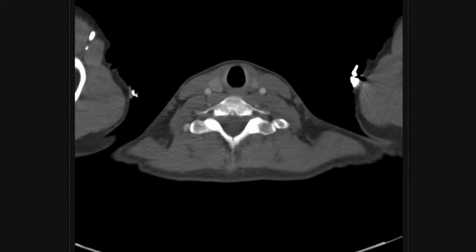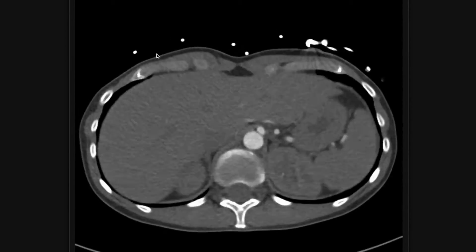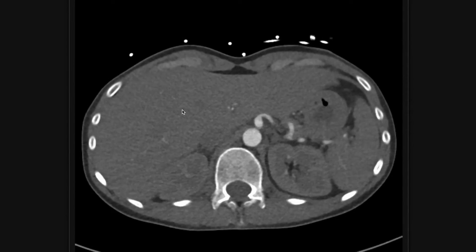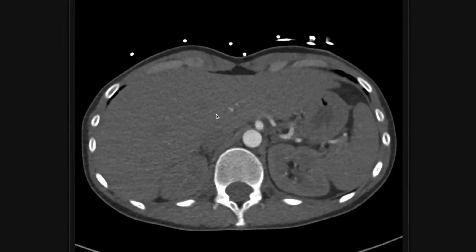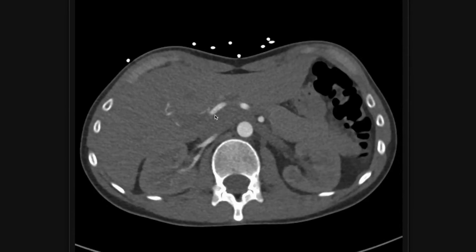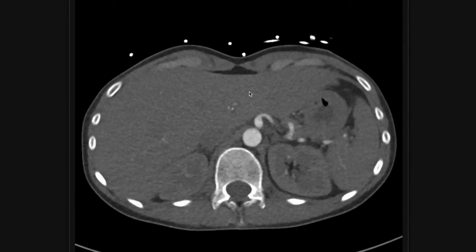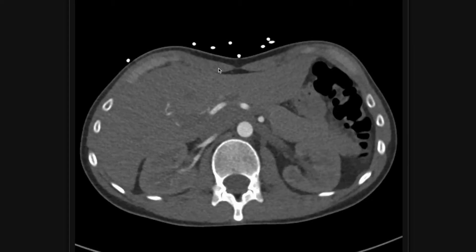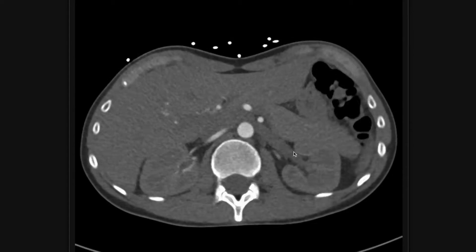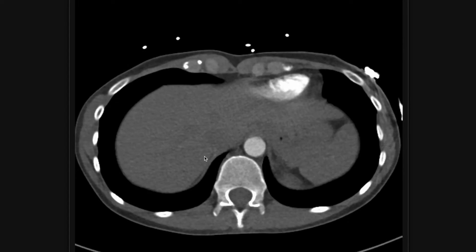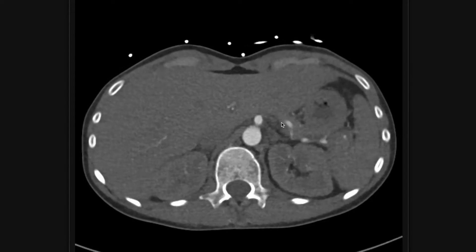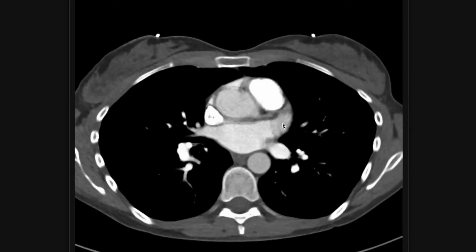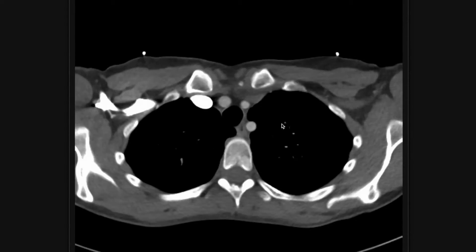After looking at the lungs, I go down and look at the upper abdomen. Sometimes you'll catch a little bit of the gallbladder — cholecystitis presenting as chest pain is not impossible, so if you see the gallbladder and it looks inflamed, think about cholecystitis. You can get some of your liver — don't miss a liver mass. You get some of the kidneys, the spleen, stomach, and a little bit of colon. Always look at the upper abdomen on any chest study.